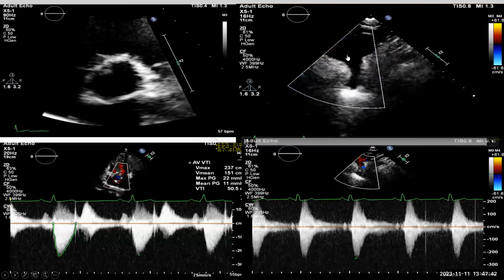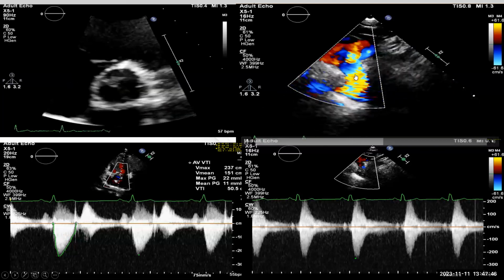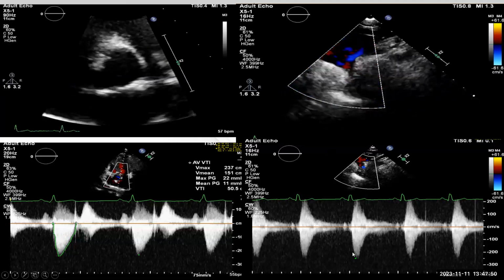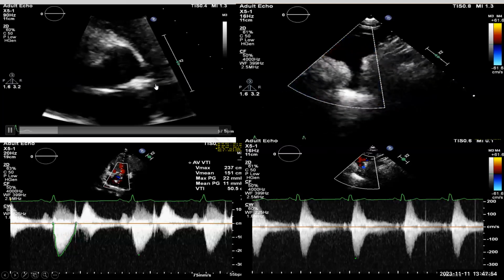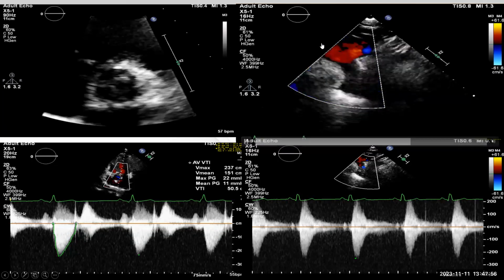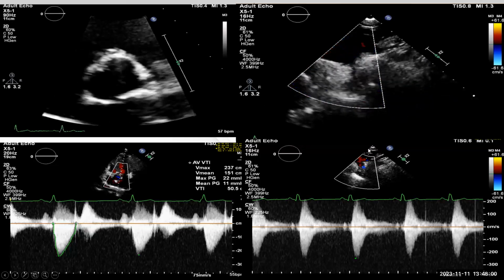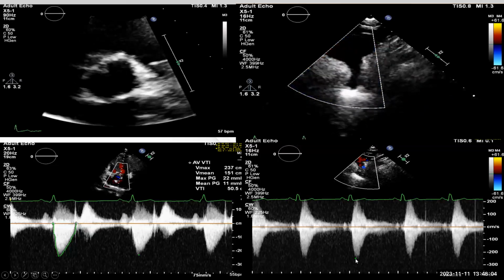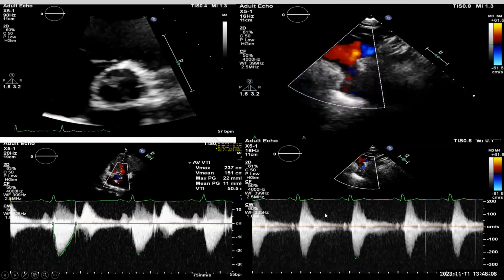Okay, you can see that there is coarctation here. It's very clear that you have some stenosis, and the gradient here is a bit high. Okay, but however, this is not typical for coarctation. But by the way, this is the suprasternal view, and this is color Doppler, and this is CW, continuous wave. The gradient here, the big gradient, is about 2.5 meters per second.